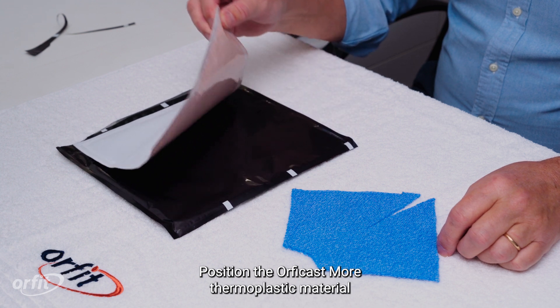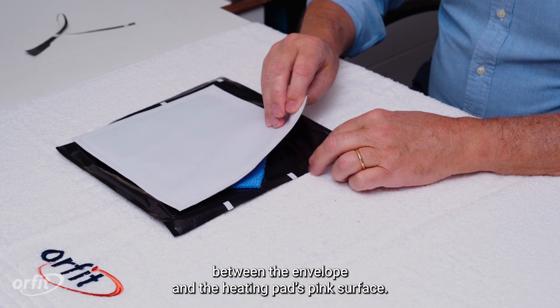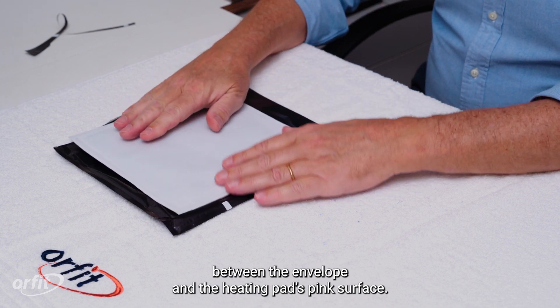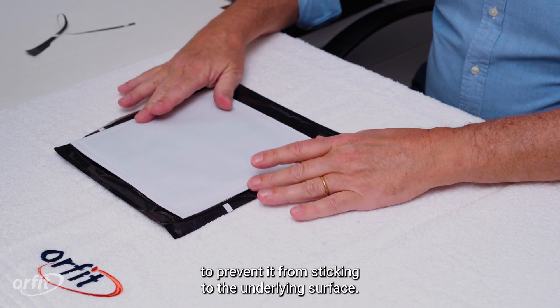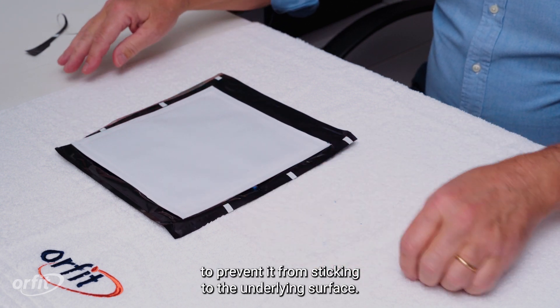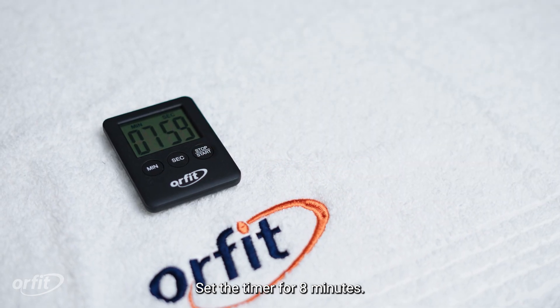Position the OrphiCast more thermoplastic material between the envelope and the heating pad's pink surface. Keep the thermoplastic material on top of the envelope to prevent it from sticking to the underlying surface. Set the timer for eight minutes.